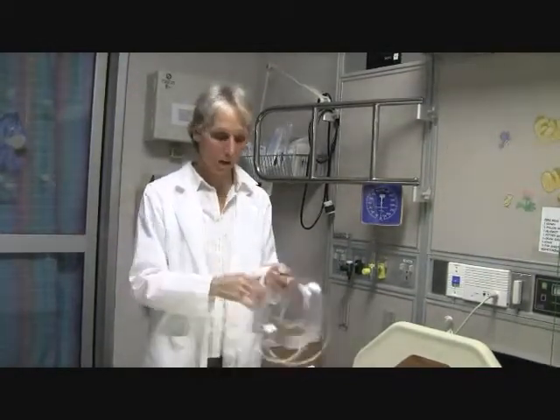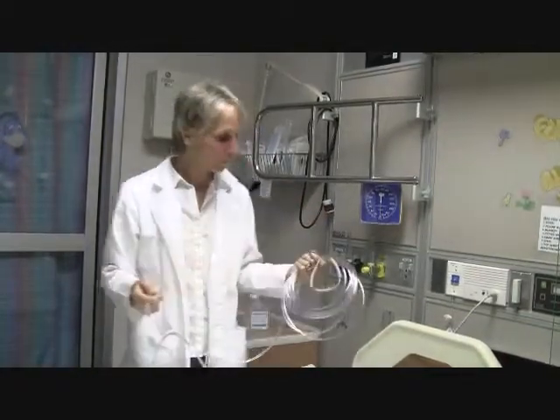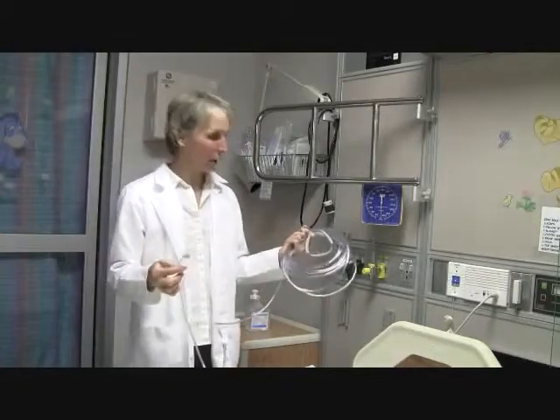Now we're going to talk about the nasal cannula. It is the most common oxygen delivery device used in the hospital setting. It's also a pretty common home therapy delivery system for oxygen. You can titrate the flow rate for a nasal cannula anywhere from 1 to 6 liters, and in so doing, you're delivering FiO2 from anywhere from 24 to 44%.